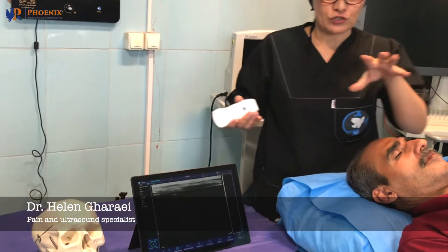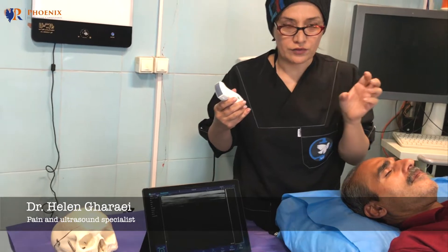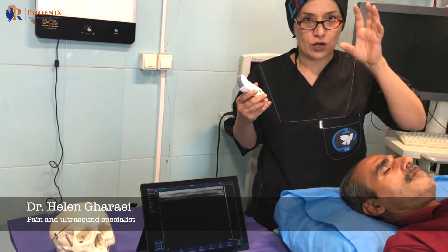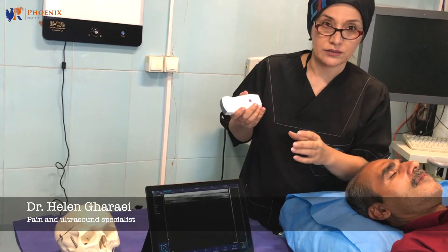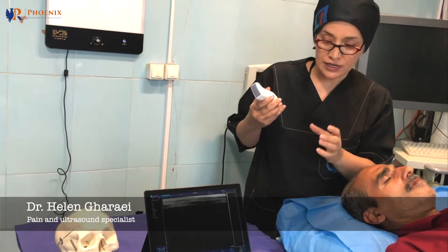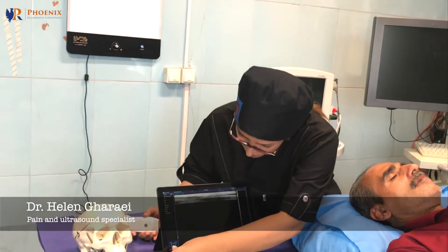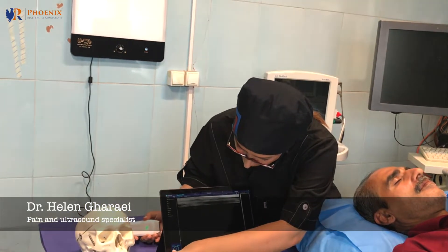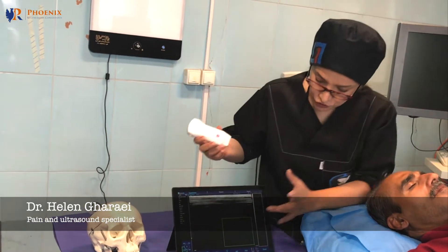You can search for the supraorbital vessel with Doppler, and it helps you better. I'll switch it to color mode and show you.